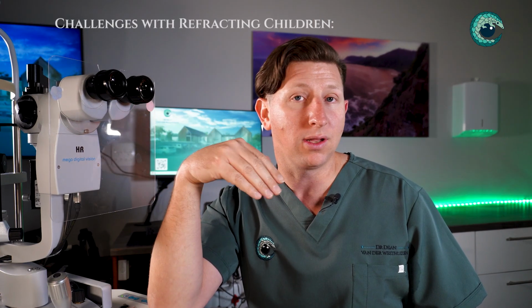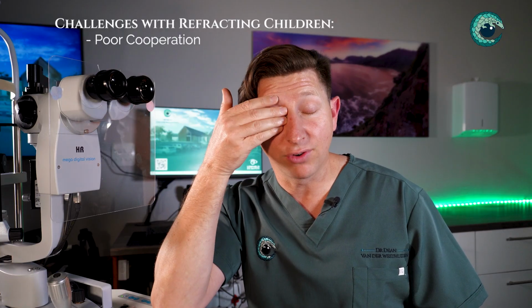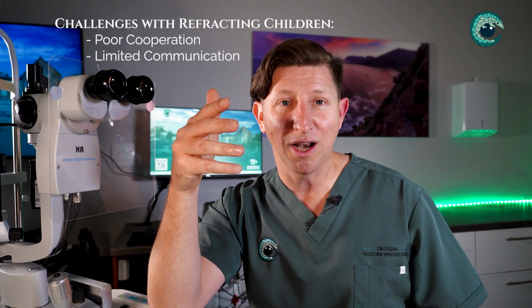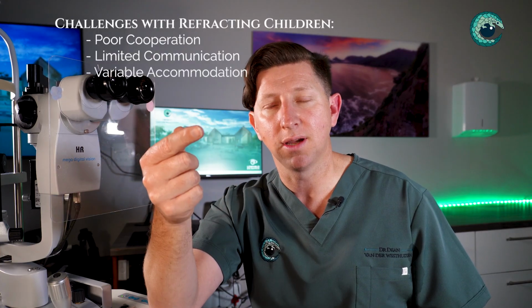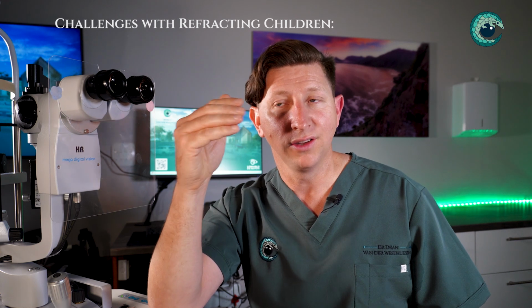In children, firstly, they often don't let you come near them. Putting lenses close to the eye, putting their eye in front of a phoropter, they really struggle with that. Their responses to whether something is better or worse are also often inaccurate, and children have an extremely strong ability to accommodate. What that means is they can change the strength of the lens in their eye a lot. So they may be focusing in the distance and then near and far and near, and so their glasses script can change the whole time you're trying to test them. And so we can't really use a phoropter and the traditional way of assessing for glasses.